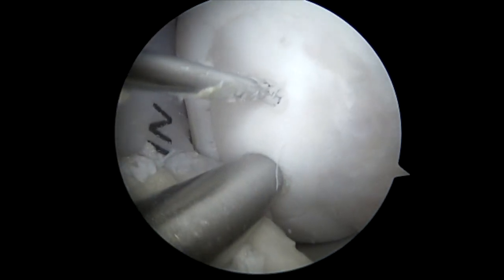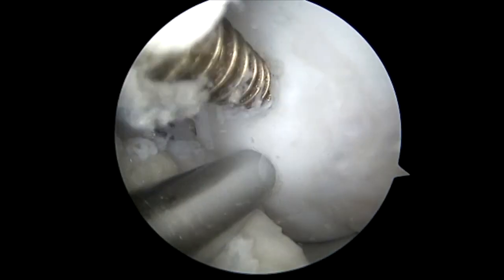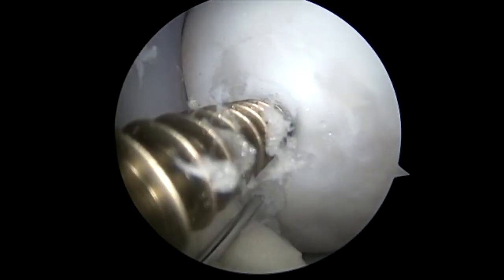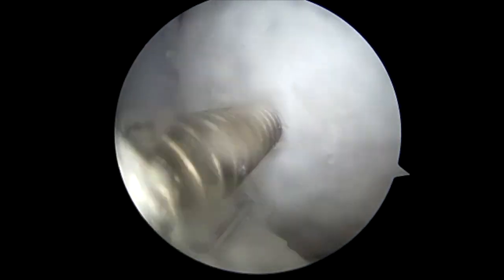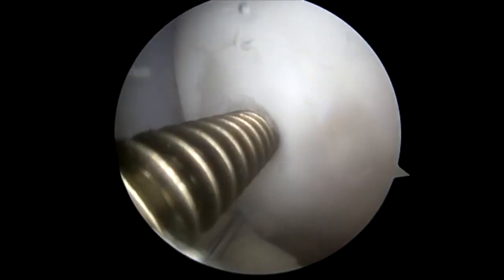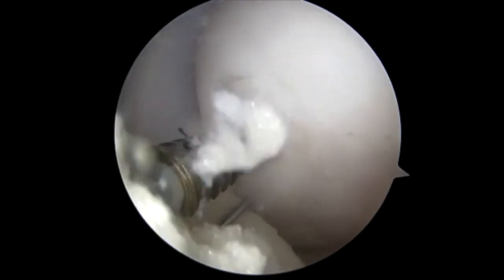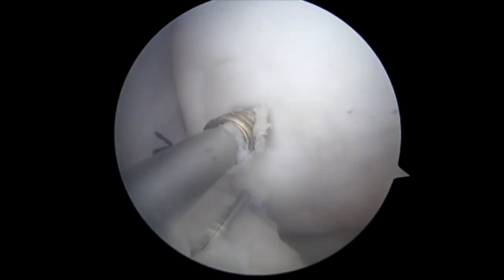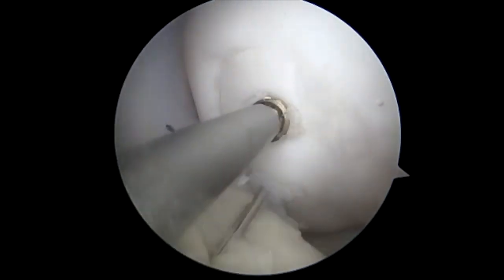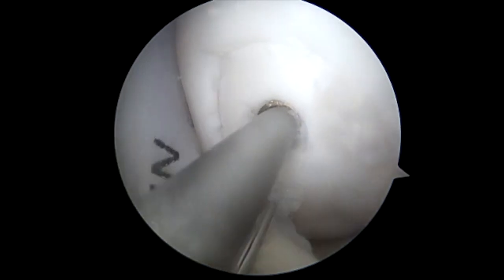Following this, we place a 2.5 millimeter arthrox headless screw. This gives us adequate compression without concern for any outcropping of the head during range of motion. We will still do non-weight bearing for 6 to 8 weeks after this, but we allow full range of motion, and this prevents any cartilage damage. As you can see, there's significant compression of the fragment. With this screw, we bury the head roughly 2 millimeters in depth.